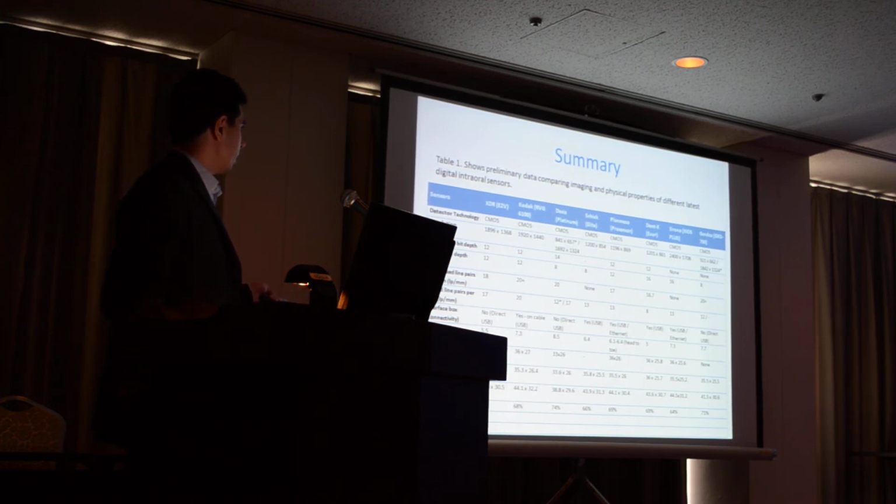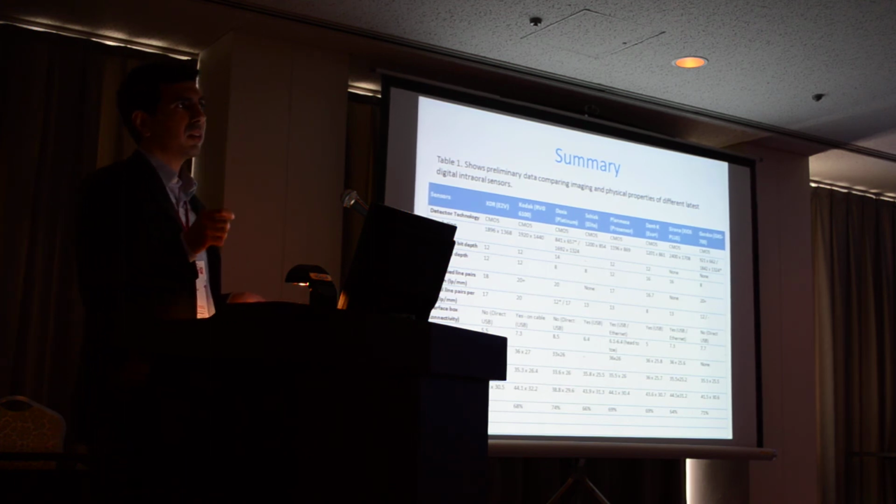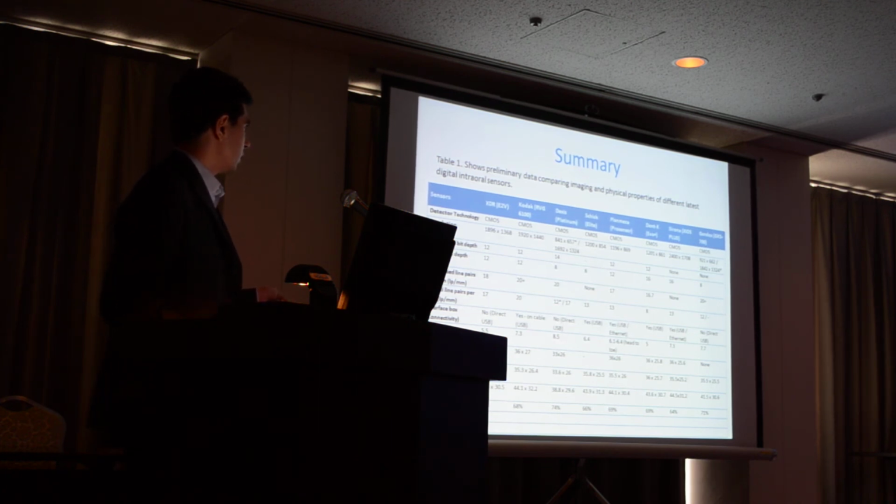We also measured the plate thickness using a digital caliper. The thinner the sensor, the easier it is to place inside the patient's mouth. And as you can see, DEXIS was the thickest sensor among the group. The advertised active area is what they say, and below, we got values very close to what the manufacturer was giving us.